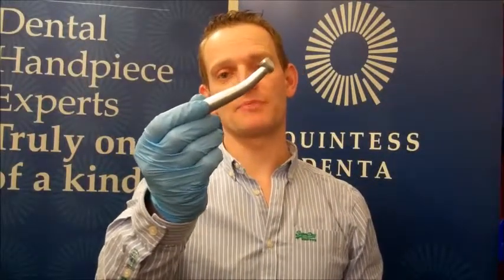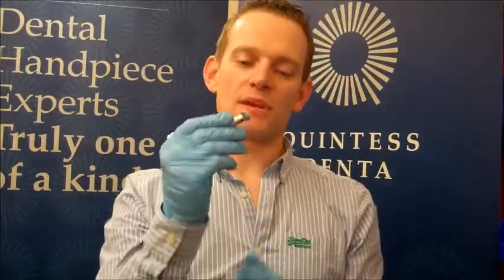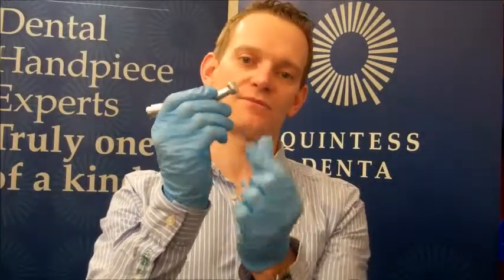We're going to look at the maintenance of a W&H high-speed handpiece. It's very important that this is cared for and maintained correctly to increase its longevity. Firstly, when holding the handpiece, make sure you've got a good grip of it. If that drops, the wall of the head is very thin and it can get dented very easily.